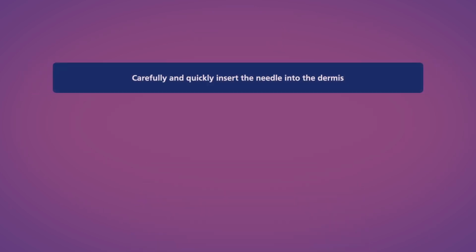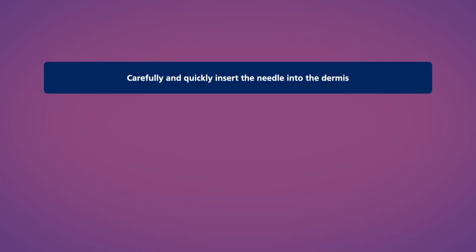3 tips to minimise discomfort. 1. You should carefully and quickly insert the needle into the dermis. Slowly inserting the needle is painful for most patients.